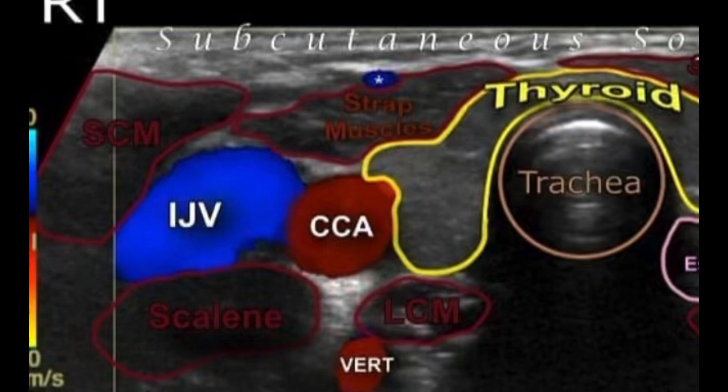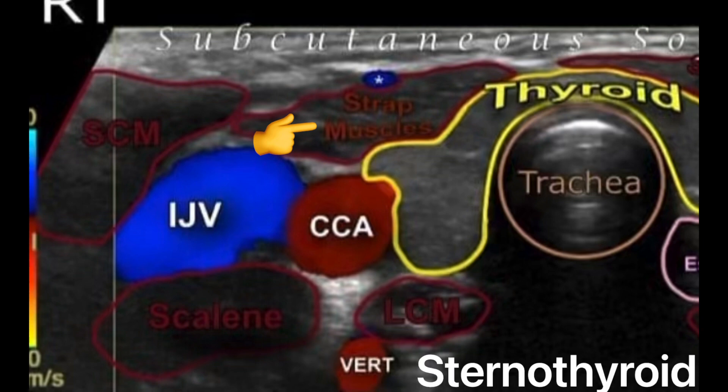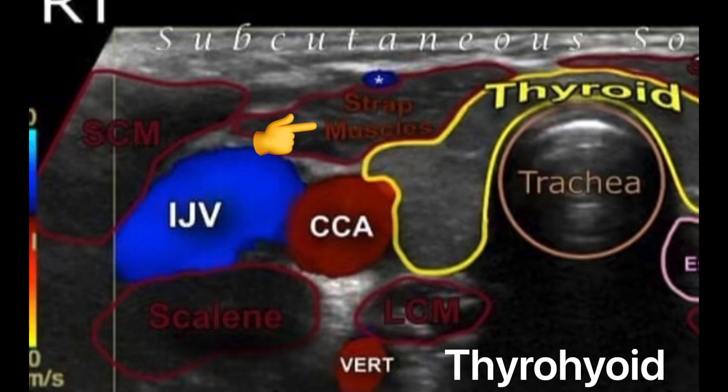Now let's go over the muscles. Right anterior to the right thyroid lobe, you have the strap muscles, which is a group of infrahyoid muscles. The names are sternohyoid, sternothyroid, thyrohyoid, and omohyoid muscles.